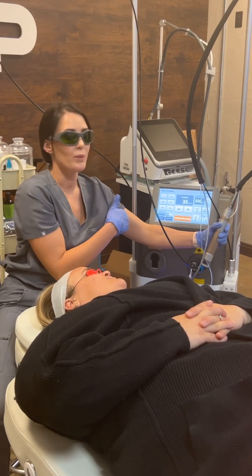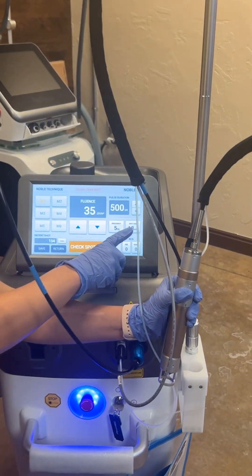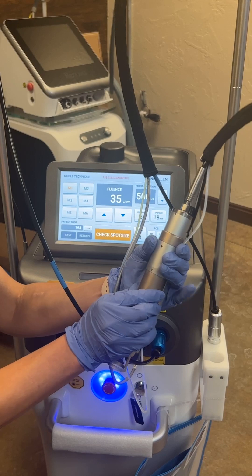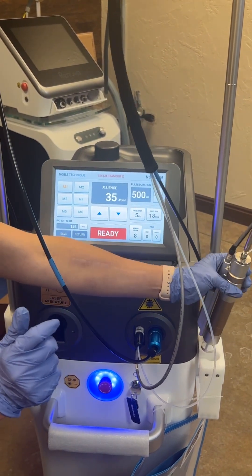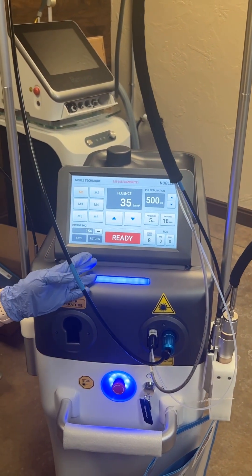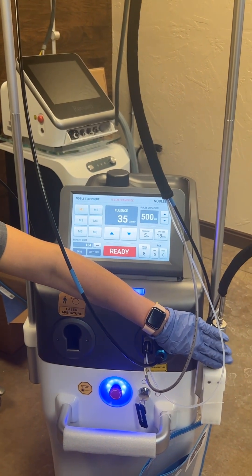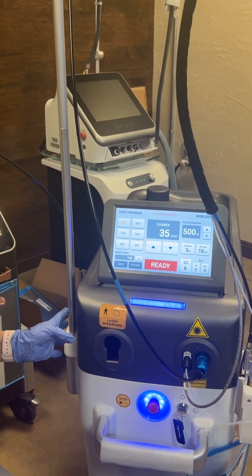When I pressed ready, one thing about this system is it says 'check spot size' — it wants me to do an 18 millimeter. As you can see with the other handpiece, it's at a 20. To change that, I'm going to be right in the middle at 18 to allow you to use the fractional handpiece. You can change it on the spot size here, but you also need to change it on the original handpiece itself to be able to utilize the fractional. That is important to know — it's a safety feature for the device to ensure you utilize the treatments appropriately.